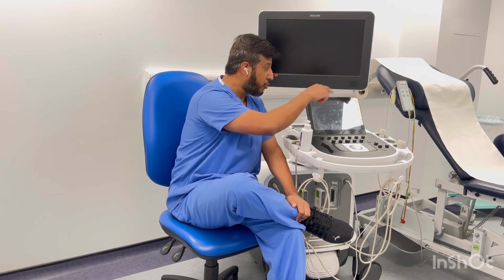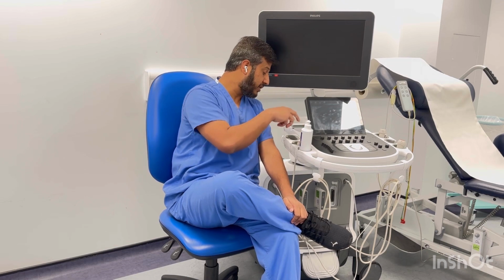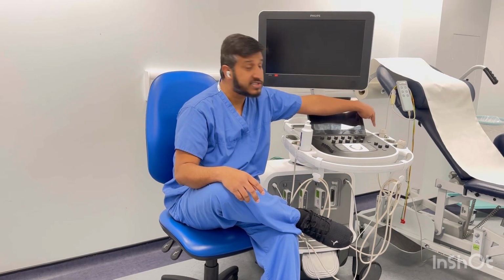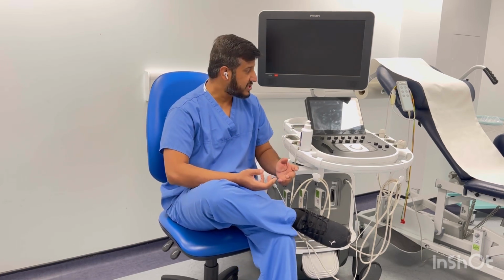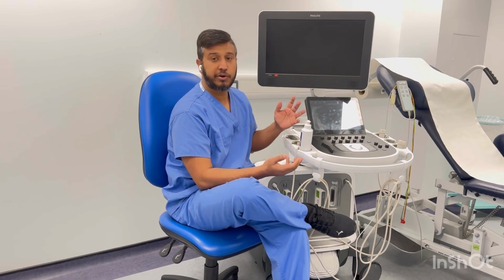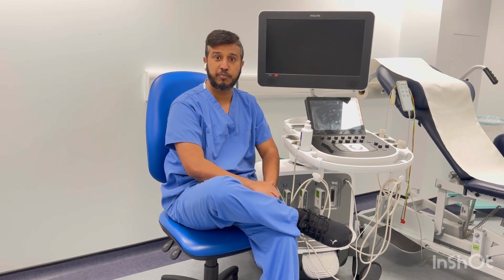There are 3 probes attached to this machine: this is one probe, this is the second one, and this is the third one. So if I ask you to try scanning, the first thing is you should know which probe you are going to use for the scanning, because there are 3 different probes attached.